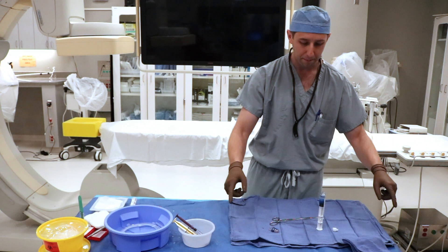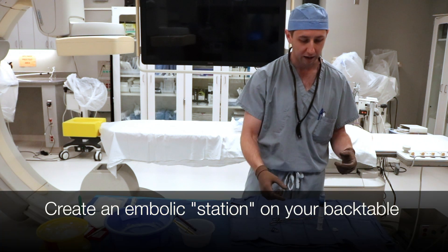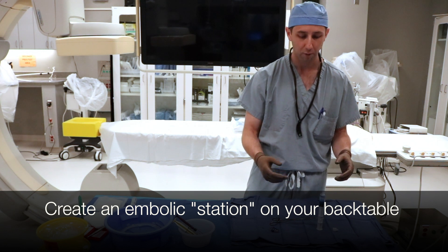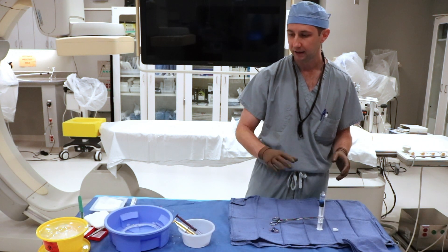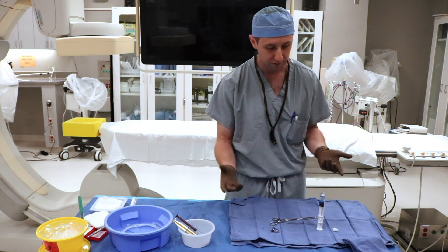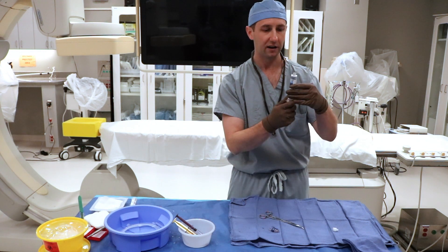One thing I should mention is I have a little embolic towel — I'll set aside a towel for embolic that'll have a little bit of contrast, some saline, and all the syringes I'm going to use for my embolic. That way my embolic station has all the stuff we use for embolic in terms of flushes and contrast, and you have a whole separate station for your diagnostic angiography. I'm going to be mixing between the two just for simplicity.